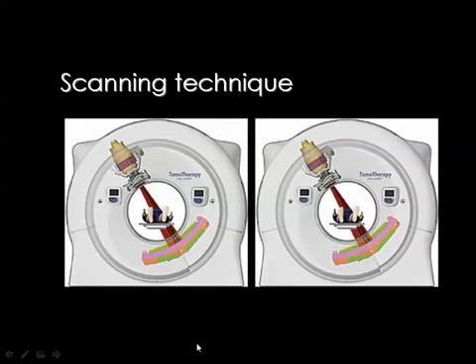In order to have a section in the human body, the X-ray tube should rotate around the human body in a full circle. This was not feasible in the old machines because the X-ray tube is usually connected to the wall or to the ground by electricity cables.